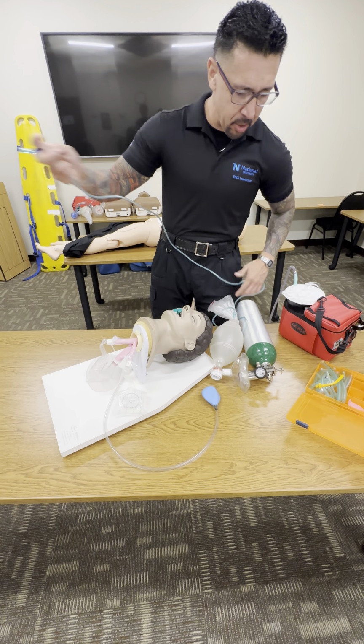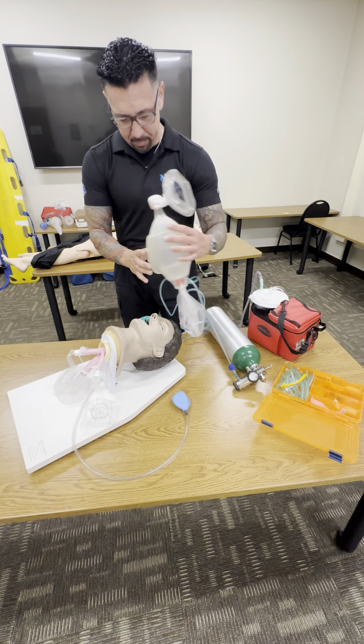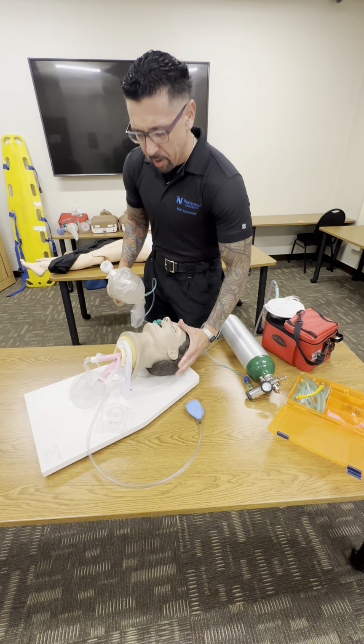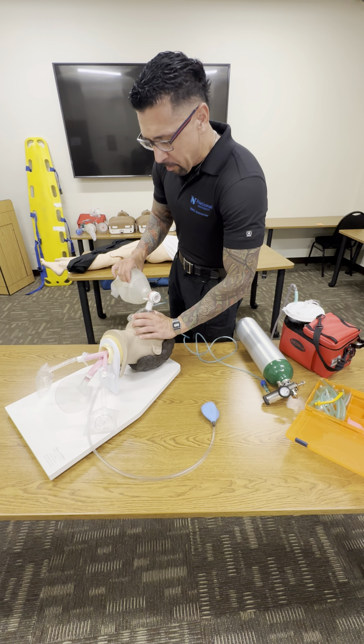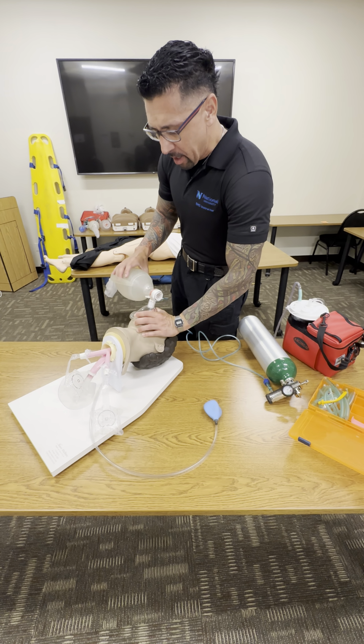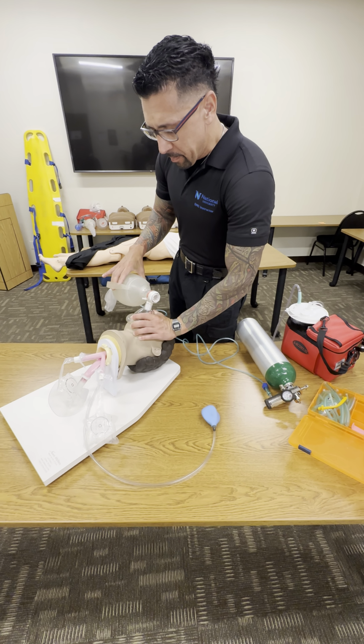BVM to my O2. That was already here. 15 liters a minute. I'm gonna start rescue breathing, 1 breath every 5 to 6 seconds. Breathe. 1,000 1, 1,000 2, 1,000 3, 1,000 4, 1,000 5. The ventilation is being properly performed without difficulty.